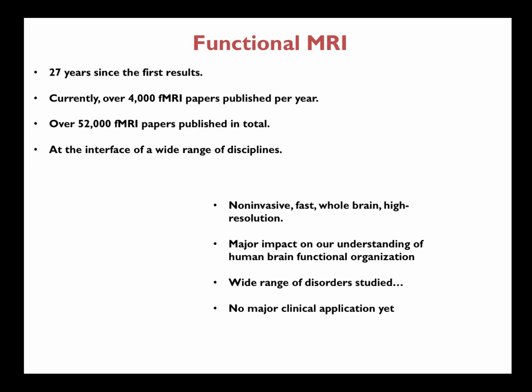There's maybe pre-surgical mapping a little bit on individual subjects, but the big problem is that for all of our neuropsychologic studies, or all our studies on clinical populations, we might derive general information about how brains are different, like their connectivity or their activity between clinical populations after we average it together. But that data might be useful for understanding things, but as far as useful clinically, it's almost useless, because what's really useful is being able to put a subject in the scanner and say something about that subject, what population they belong to. So that's something to think about.